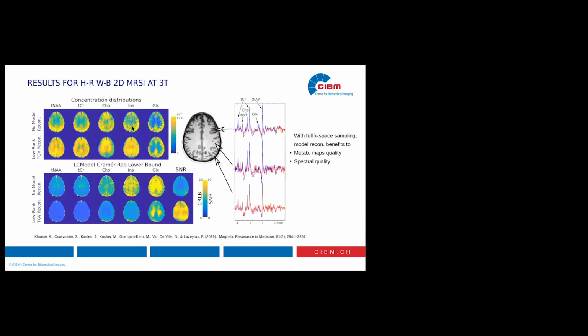I think in this case, having some good phantom data and good simulation data is also the key to answer this question. Of course, in vivo, as you said, that's a nice picture and a nice illustration, but based only on in vivo data, that is not sufficient. And I think the analysis that we did on simulation data and also on phantom data can at least ascertain that we can reach a given resolution.